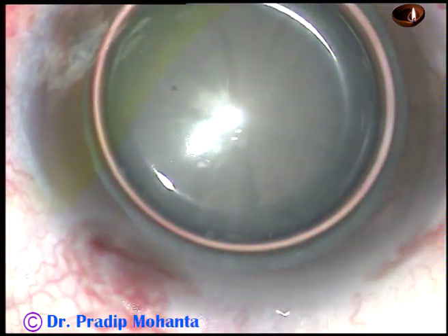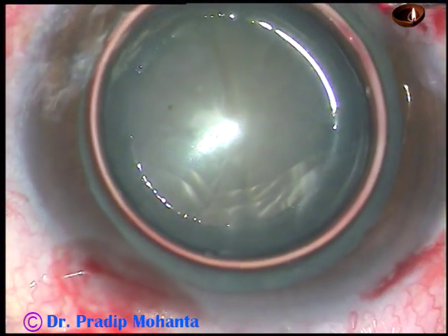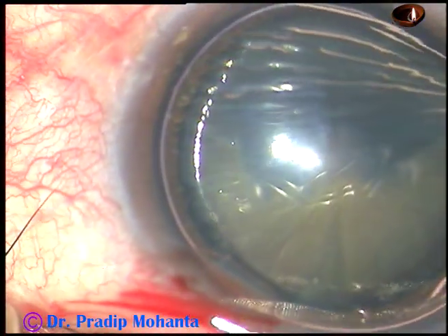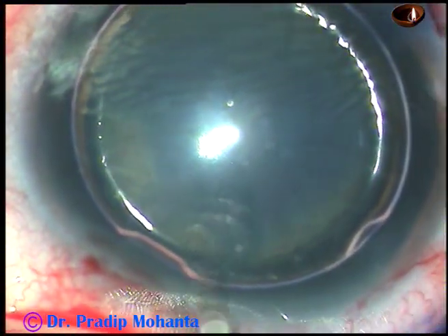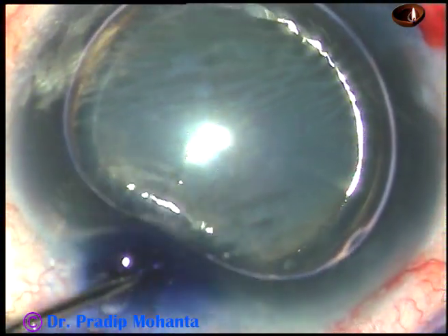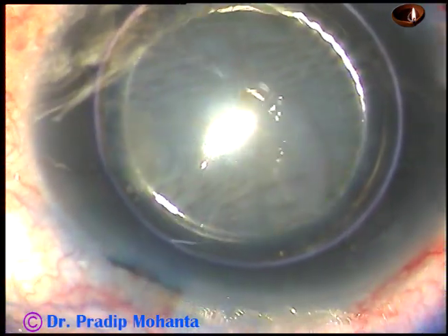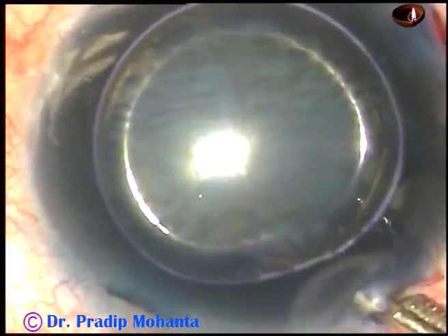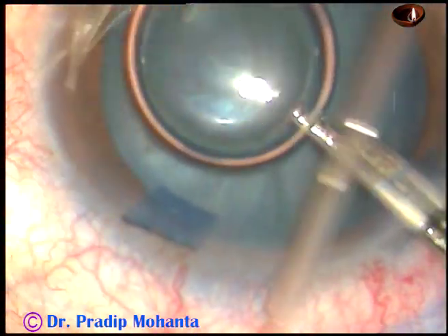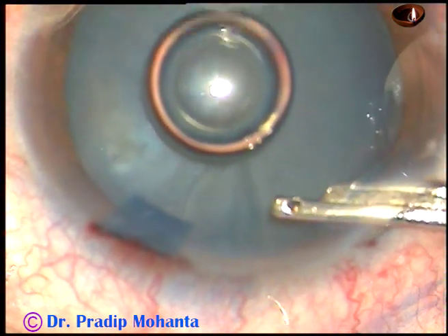An air bubble is injected into the anterior chamber and then trypan blue 0.06 percent dye is applied over the anterior surface of the cataractous lens to stain the anterior capsule. The air bubble cannot dilute the dye, so the staining is very fast. Now I wash the dye out thoroughly with BSS and leave BSS in the anterior chamber.